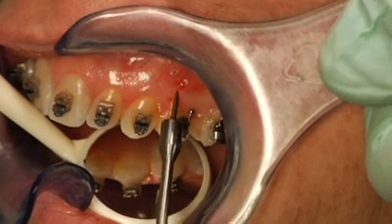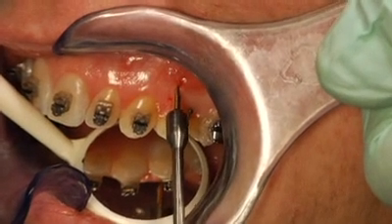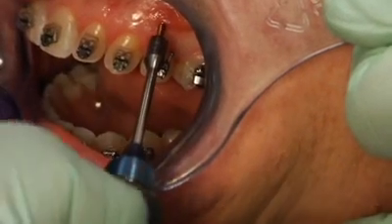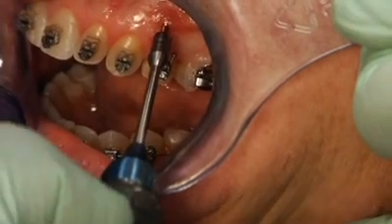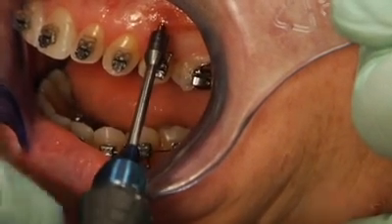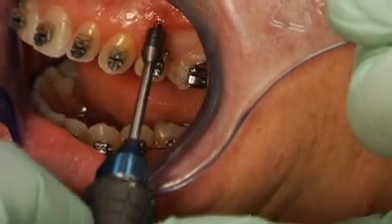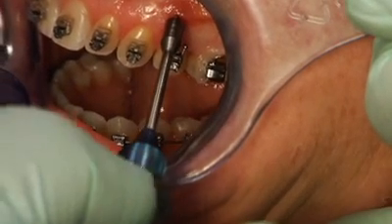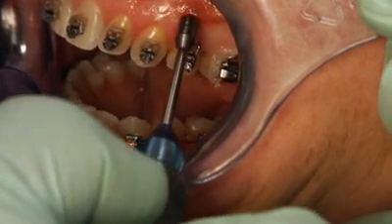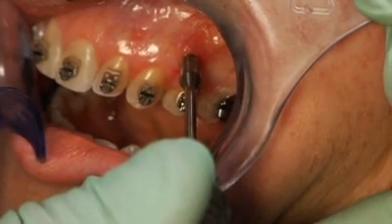Place the screw just below the mucogingival junction and advance the screw with firm, constant pressure. Don't allow the screw to wobble, which can widen the hole and increase the chance of failure. When the head of the driver is flush with the tissue, you've driven the mini-screw to the proper depth and can detach the driver from the head.